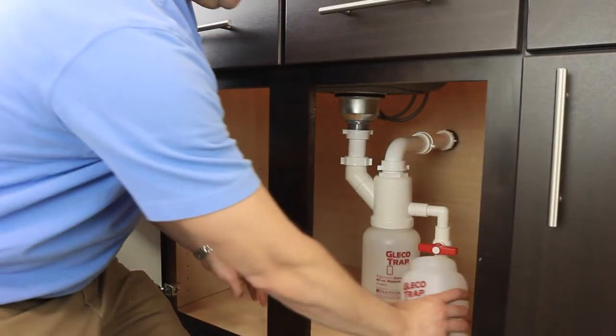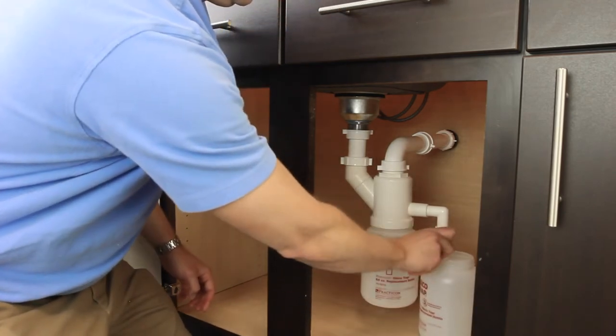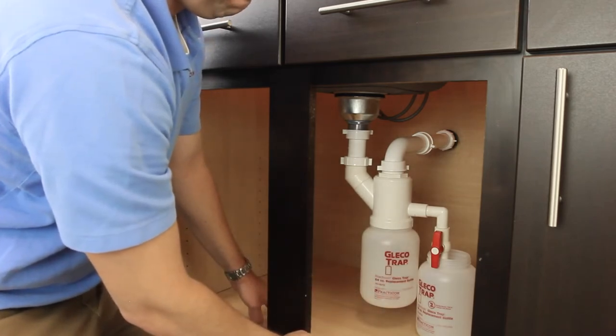Replacing your GlecoTrap takes only 90 seconds or less. First, open the red side drain to siphon the water that sits on the top of the trap. Use the replacement GlecoTrap bottle to catch the water.